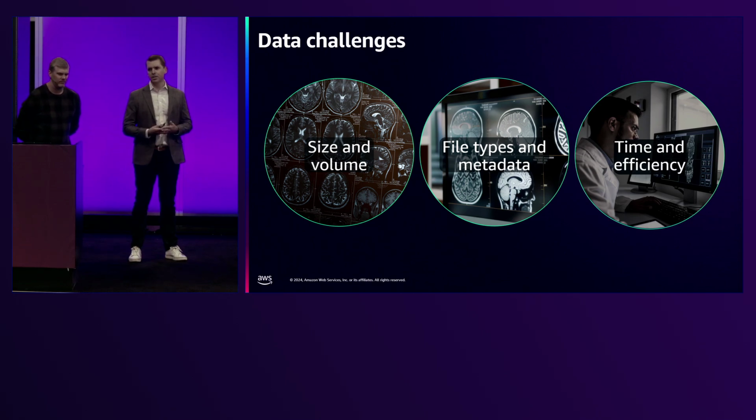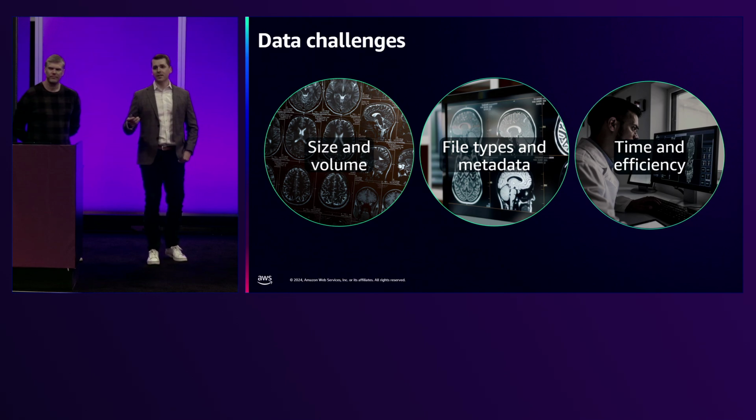Just as an example, a typical CT study would contain anywhere from tens to hundreds, or even, I would say an average of about 1,000 slices per image. So if you think about imaging of an organ, and 1,000 individual image slices, if you just took 1 second to look at each image slice, that'd be over 16 minutes. So you can think about the challenge that radiologists deal with each and every day when they're trying to evaluate such a massive amount of data. And that's just looking at the images. You're not even talking about insights, or summarizing, or all the ancillary activities that go around supporting the radiologist in their workflow.